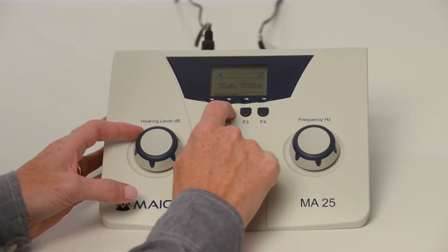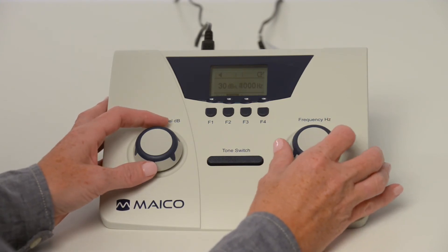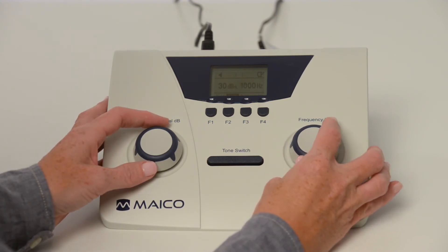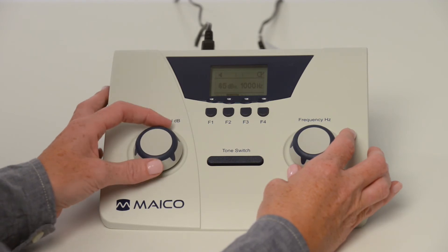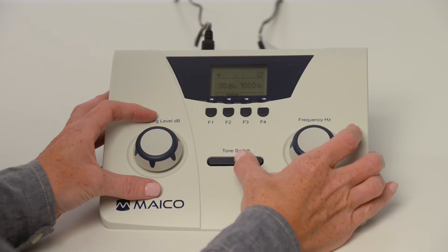Select right or left ear with the function keys. Select the test frequency with the right frequency dial. Select volume level with the left hearing level dial, and press the tone switch one to two seconds to present the tone.